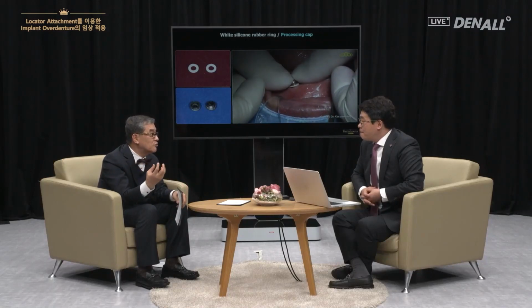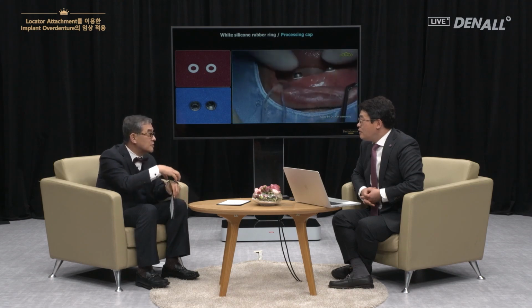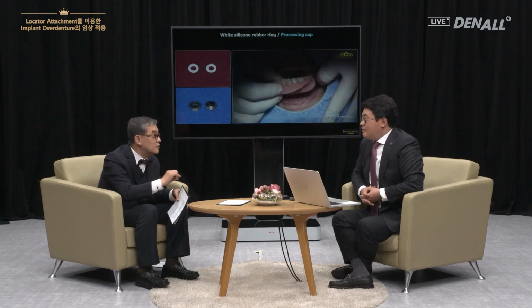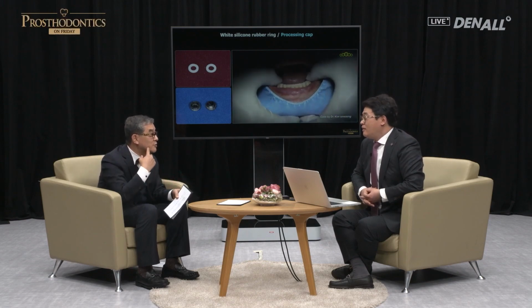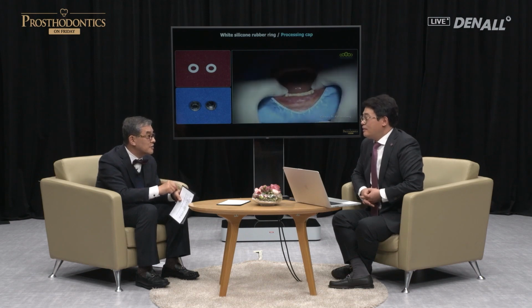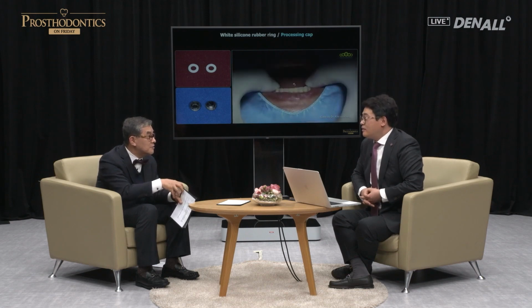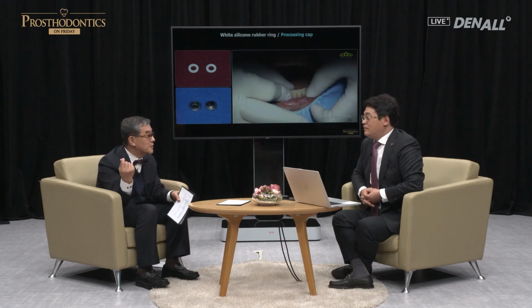And then you can see that it is coming out there. There's a bit of space. And I believe this also gives legroom in terms of vertical movement. Because there's a strong tissue support, it sort of rocks back and forth. If you make it fit, it is concentrated on the implant and it moves together. And at times we call that space.